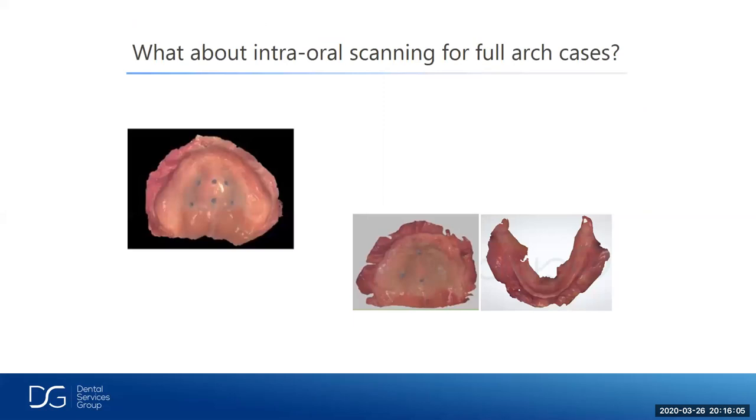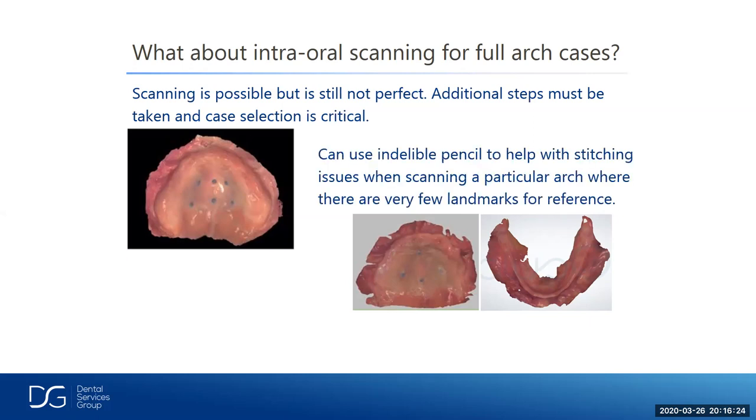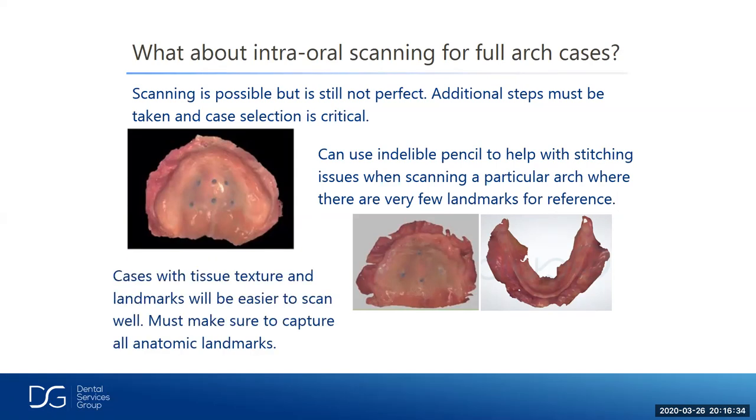And people ask me all the time, every time I'm doing my seminar, what about intraoral scanning on full arch cases? Well, there's still a challenge with this, capturing all the anatomical landmarks with fully edentulous intraoral scanning. Scanning is possible, but it's still not perfect. Additional steps must be taken, and case selection is critical. You can use an indelible pencil to help with stitching issues when scanning an arch where there are few landmarks for reference. Indelible pencils will help. And cases with tissue texture and landmarks will be easy to scan well, and we must make sure to capture all these anatomical landmarks.